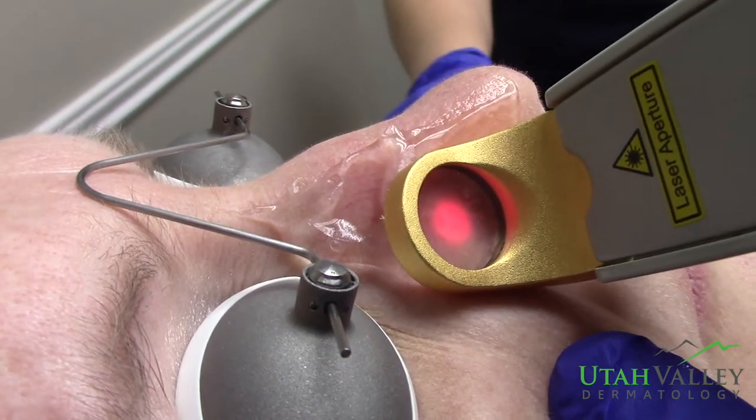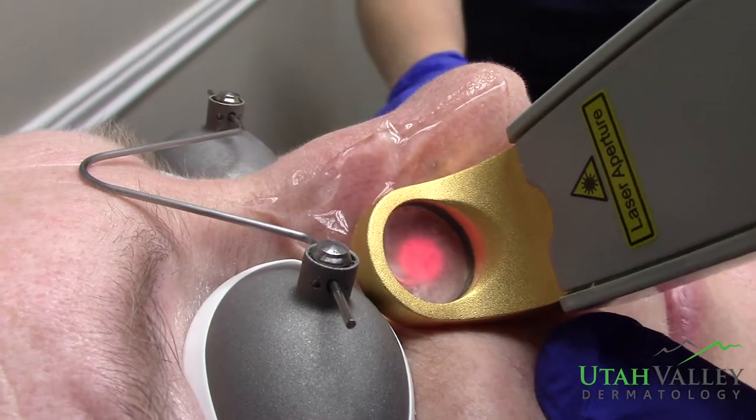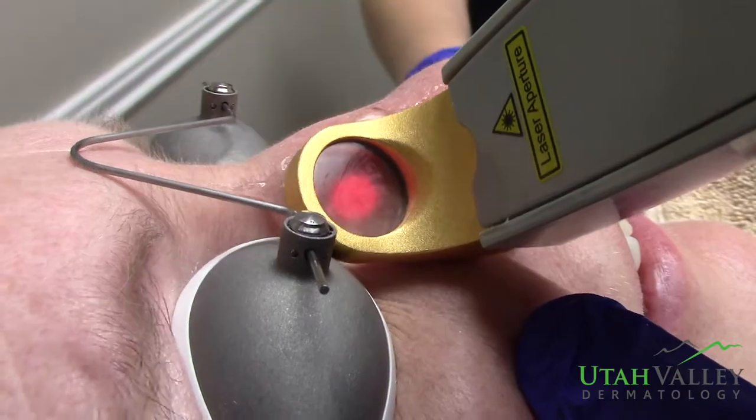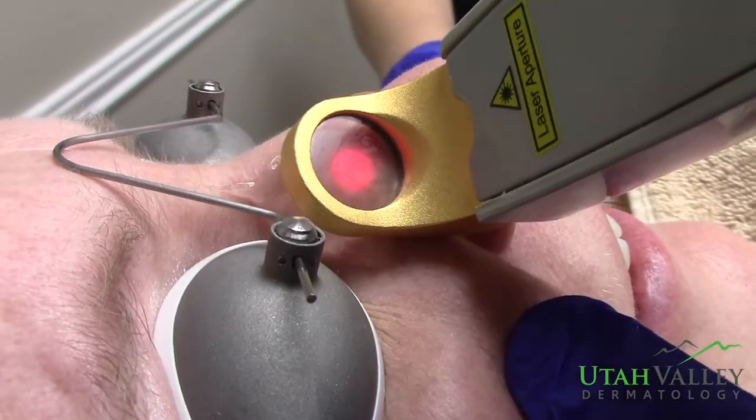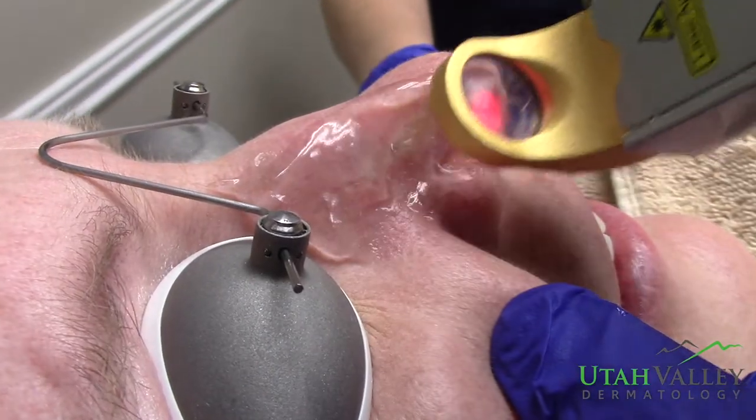Okay, you're going to feel a little zip. One, two, three. How is it? Fine. Just a little — it's like a rubber band snap. It's not too bad, it's just a little shocking. Just don't forget to breathe, okay? Okay.